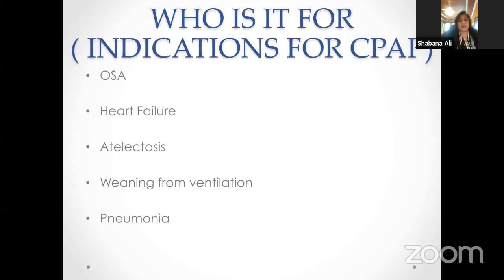Another indication is to use it when the patient has atelectasis, because there is no additional pressure coming up. So in CPAP, no additional pressure above the set level is provided, and the patient has to initiate all the breathing. So the application of CPAP maintains the PEEP, and this prevents the atelectasis, increasing the surface area of the alveoli for proper exchange of gases, and that improves the oxygenation.